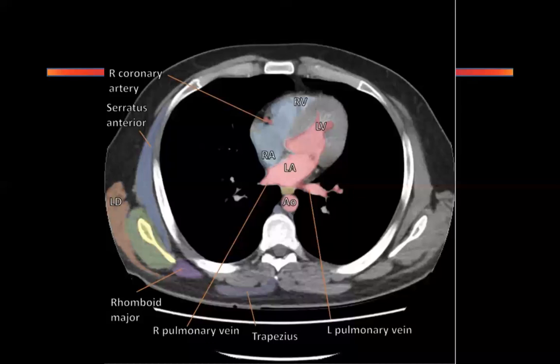Is it okay so far, so good? Yes, sir. I will go through all of this in another session. Just stay with me. I'm going section wise just to make it easy for you to understand.